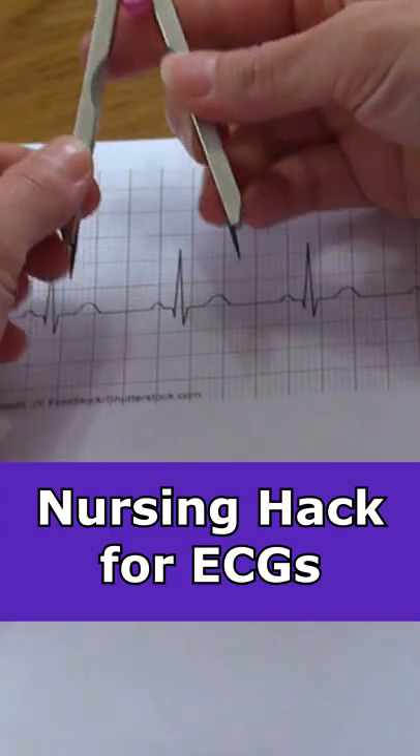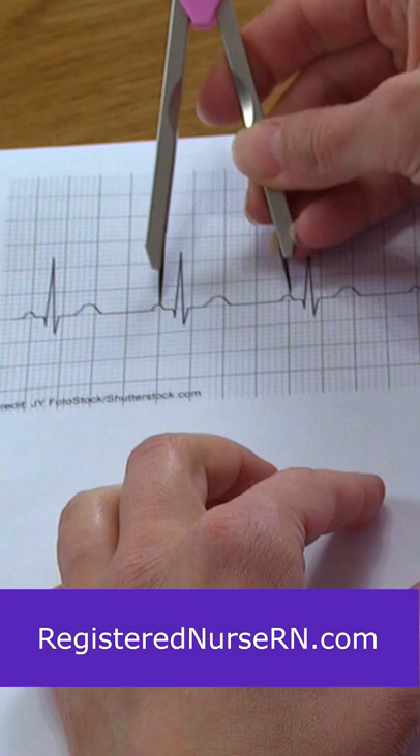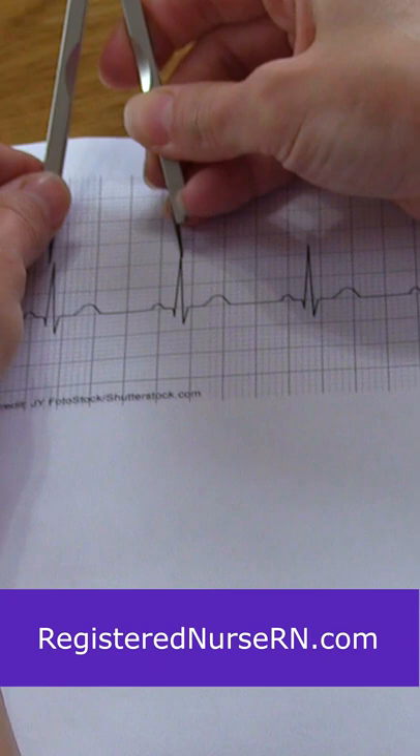Calipers are really handy whenever you're needing to interpret an EKG rhythm. For instance, whenever you're looking at the regularity of that rhythm, you can go from P wave to P wave and just track it down through that strip and see if those P waves are regular, along with the QRS complexes as well.